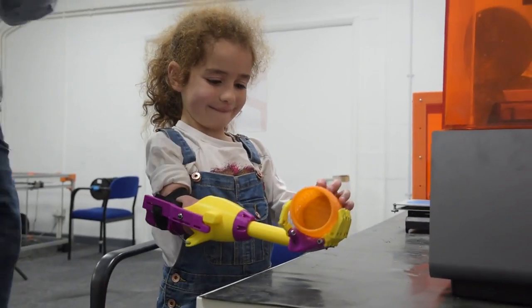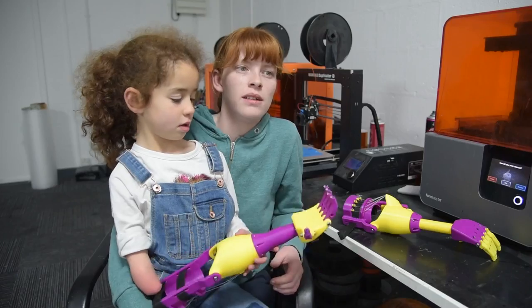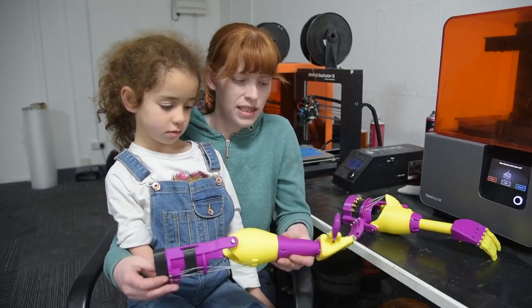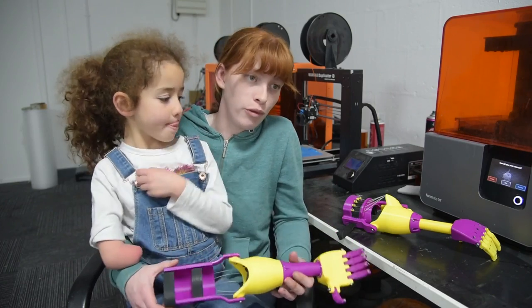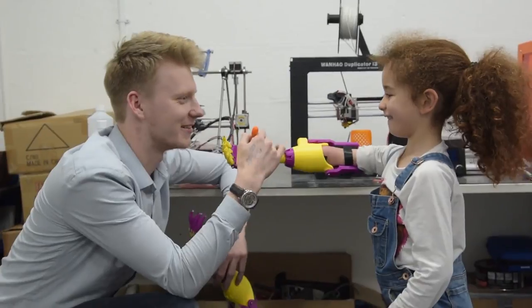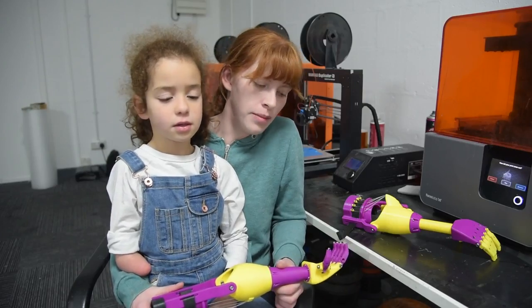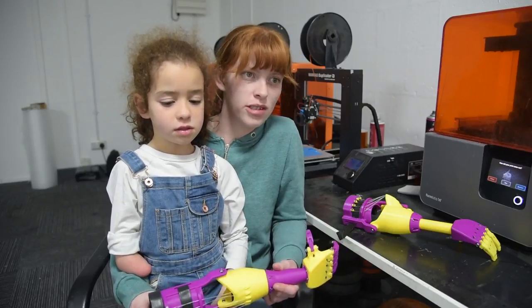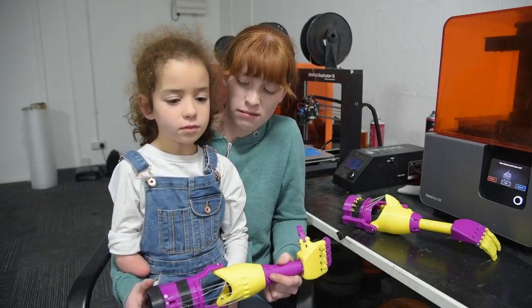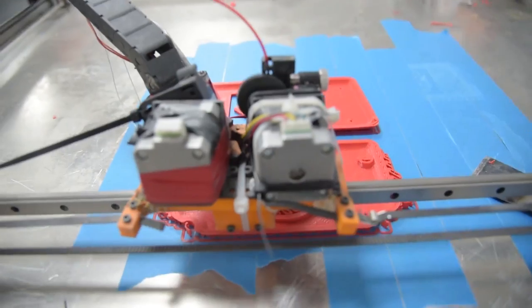We built the first prosthetic here and then Ben thought he could make massive improvements to it, so Ben's been designing and making newer ones to hopefully be more suitable for Charlie growing up. They're just tweaking the designs as Charlie uses it — letting Charlie take it home, have a couple of weeks with it, and then we come back with any faults or improvements we think can be made, and then Ben goes on to work out what can be changed.